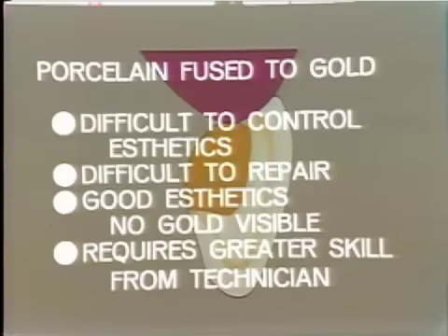and whenever the situation is critical, to send them some type of preformed facing as a guide as to just exactly what is required. They are difficult to repair, but fortunately, if they're correctly designed, they very rarely break. When they do break, it's generally necessary to remove the bridge from the mouth in order to effect a satisfactory repair. The aesthetics of these cases can be extremely good if they're well done and it's carefully controlled, with the great advantage that no gold need show at all.